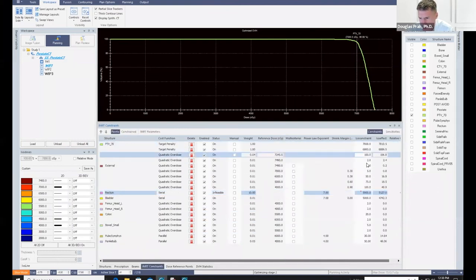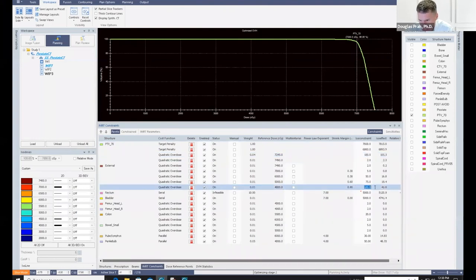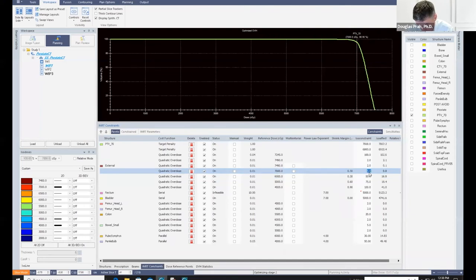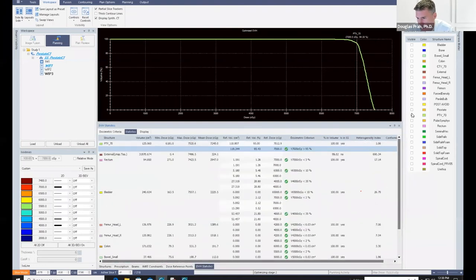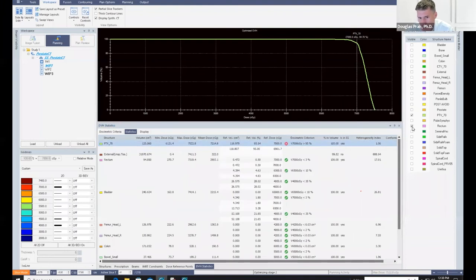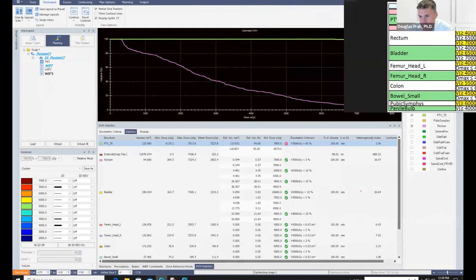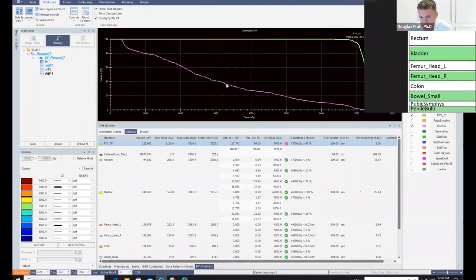and we look, so I eased off on this quite a bit. So you can see that's the 7245. And then you can see here, these are those rings that we put on. So right now we're asking for, like, 75, we're getting 19. And then for prescription, it looks like we're doing a pretty good job. We could tighten that up a little if we need to, but everything is meeting. And to put things into perspective, let's just take a look at our rectum. Here, for the rectum, we wanted 65 less than 10. And overall, it's doing a pretty good job.